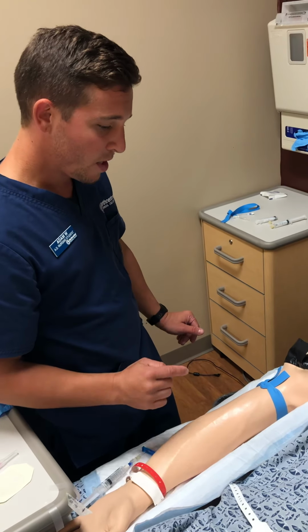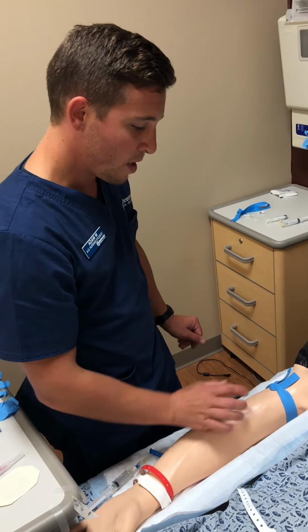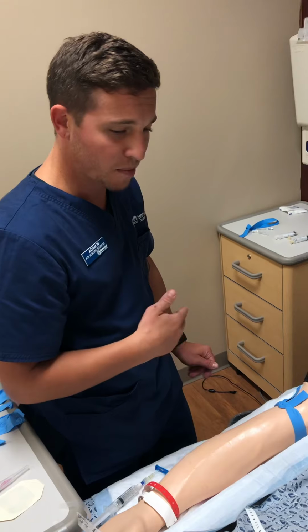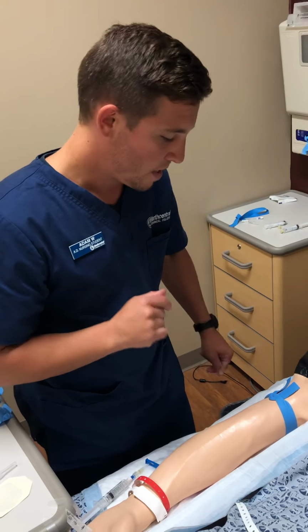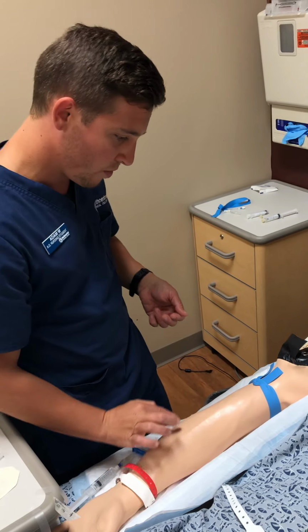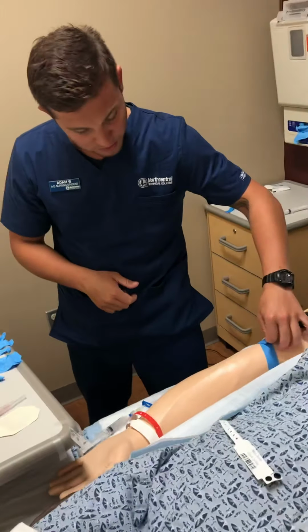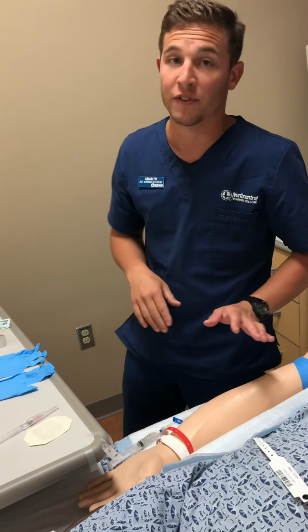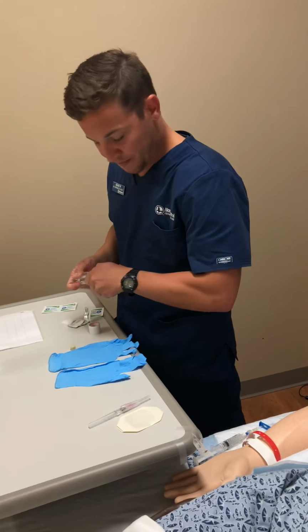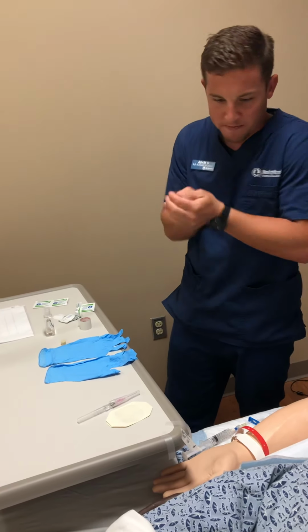Some ways to get those veins to dilate is you can tap. You can take our tourniquet off, apply some heat source up to 15 minutes. That'll help dilate veins as well. So I see here, this is the one that I'd like to use. Like I said, dependent. Looks great. All right. So let's just pop that off right now because you only want that on for the max of 2 minutes. All right, so let's use a little bit more hand sanitizer. We're going to put some gloves on here.